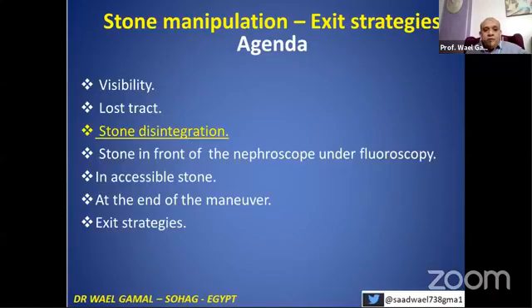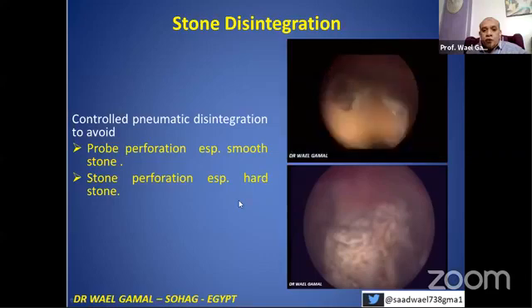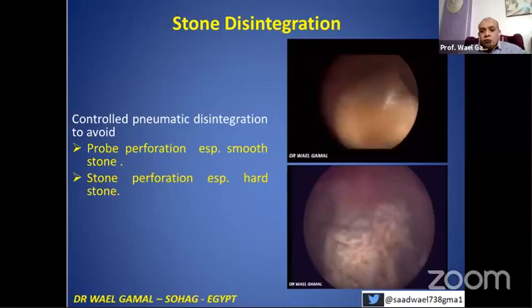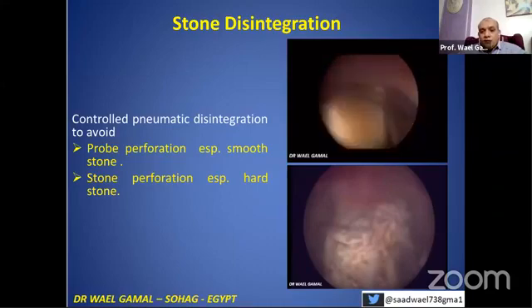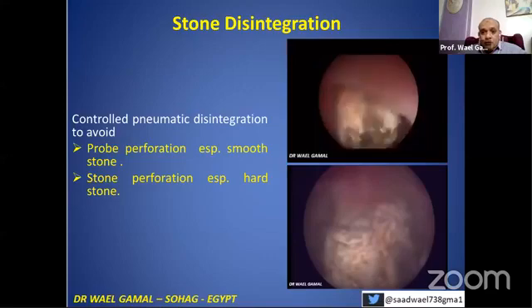Stone disintegration — what are the tips and tricks? First, when you are using pneumatic, especially with a soft stone, you have to hold the probe in your hand — do not put the probe over the stone. Avoid transfixation, especially with a smooth stone like this. The probe will transfix the stone, and once this occurs, it will lead to bleeding.